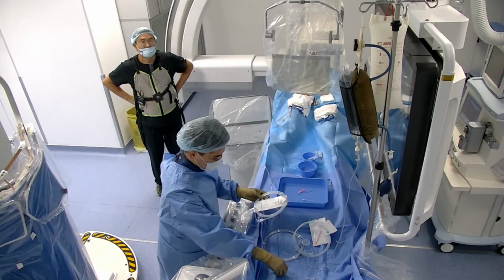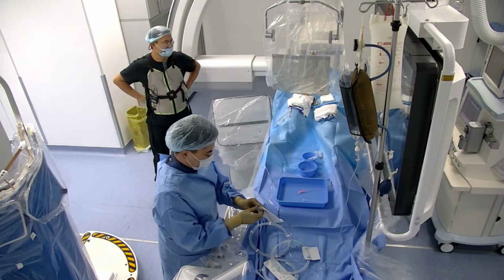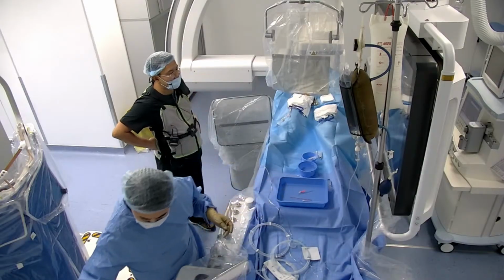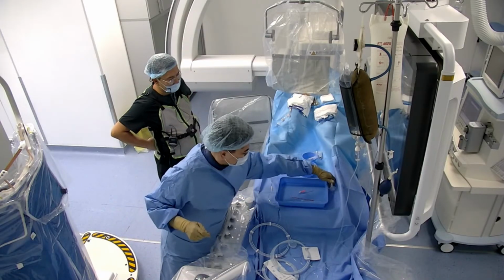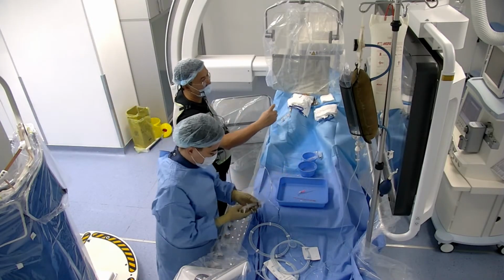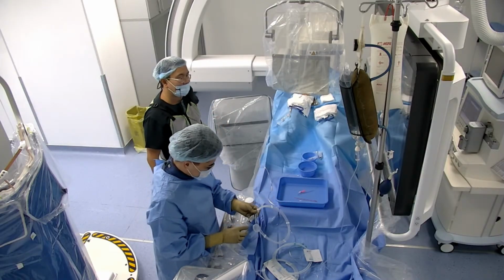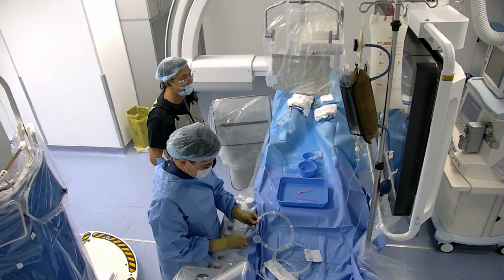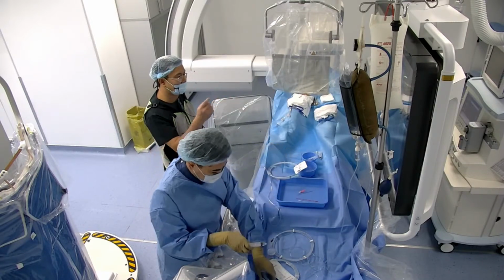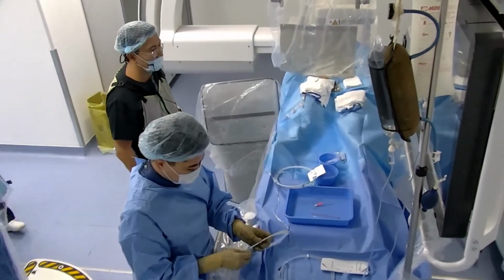Okay. The access is a 7 French Fubuki through the 7 French short sheath, and now we're preparing the Headway 17, 90 degree, short nose. With the Chikai Black, we will place the Eclipse double lumen in the MCA, then we'll place the Headway 17 in the aneurysm with the same microcatheter.